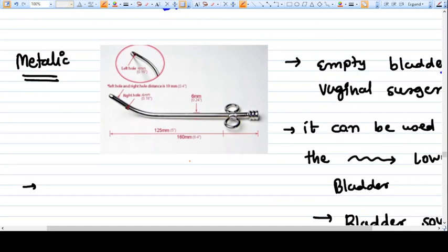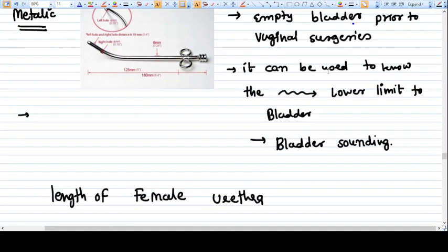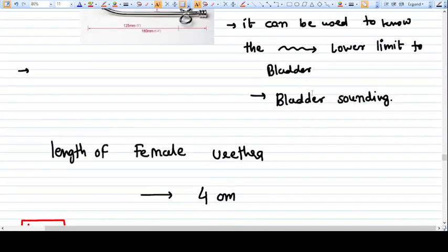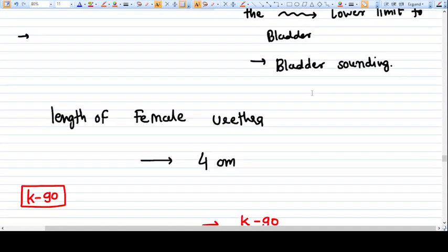This is how the metallic catheter looks. It's mostly used nowadays at the time of vaginal surgeries when you need to drain the catheter frequently. Simultaneously, it's also acting as a bladder sound, meaning it can be used to know the lower limit or boundary of bladder onto the anterior vaginal wall. This helps with various vaginal operations like colporrhaphy, anterior and posterior colporrhaphy. The length of the female urethra is four centimeters - you should know this.